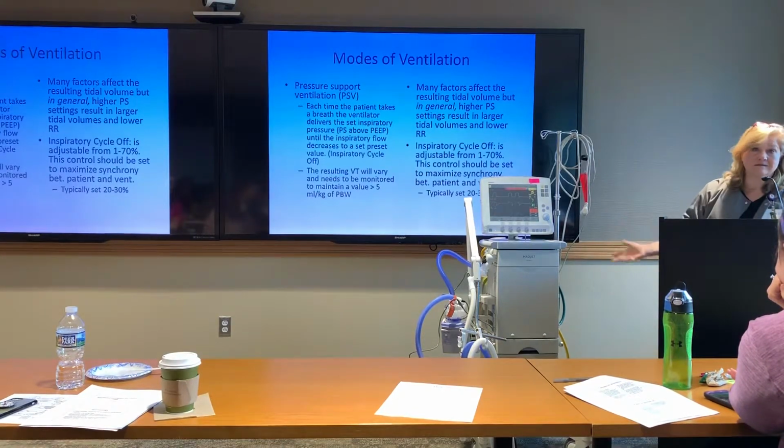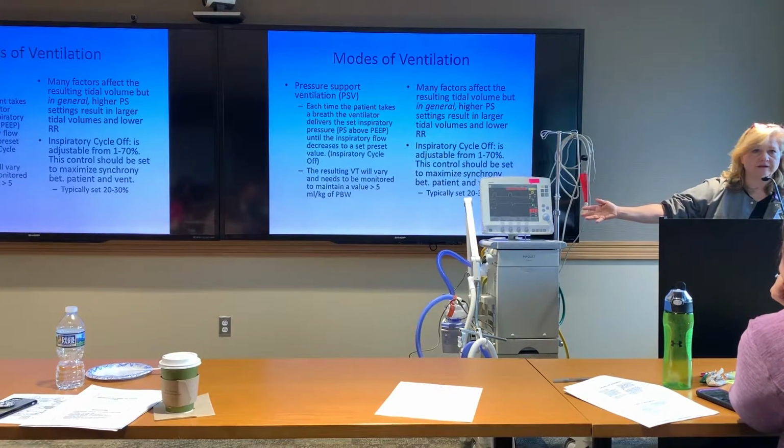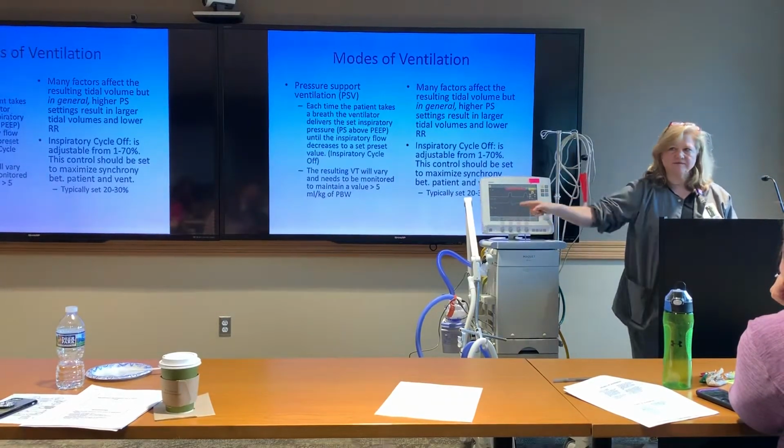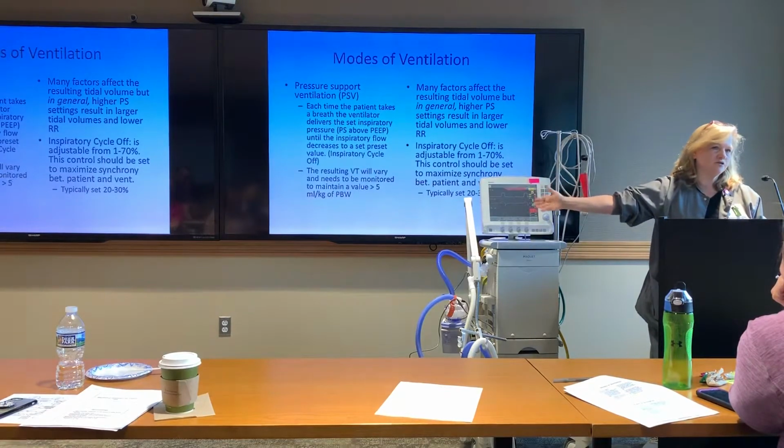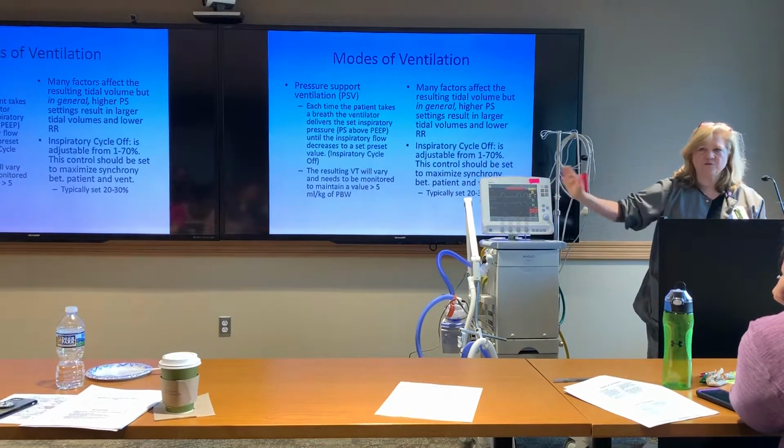Oh, it silences. And now the patient's getting breathing, right? Looks like he's breathing just fine. But do these pictures look like the ones I was just showing you? No, very different. This is very mechanical. That's because these are assist-controlled breaths. The ventilator is doing the breathing.